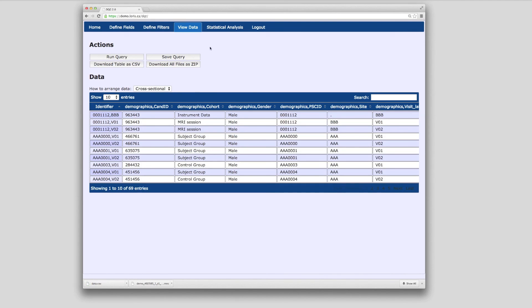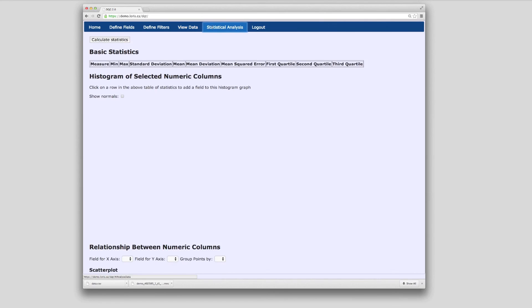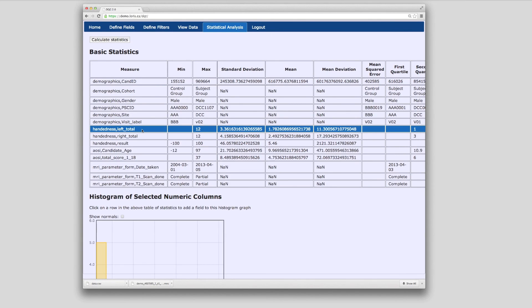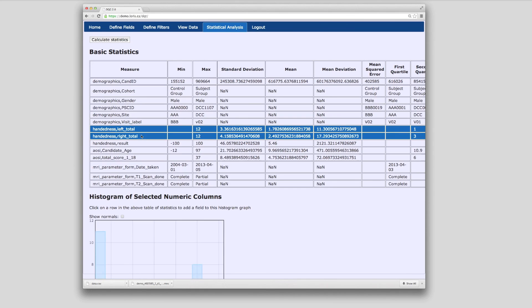Basic statistical tools are also available for simple analyses and data quality checking. Min, max, standard deviation, and other calculations are shown. Histograms can also be generated on any numerical column of choice.